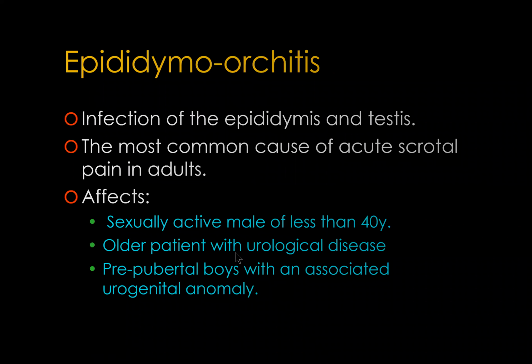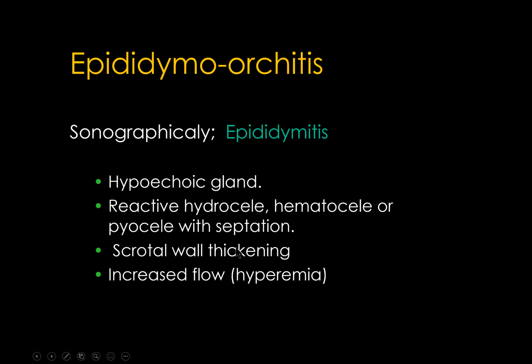Sonographically, epididymo-orchitis will appear as a hypoechoic gland. Sometimes in the epididymis, it will appear as a hypoechoic gland. Sometimes there might be reactive hydrocele or hematocele, or sometimes pyocele with septation and scrotal wall thickening. On color Doppler, there is increased flow, which is a mark of hyperemia. This will confirm the diagnosis of inflammation.